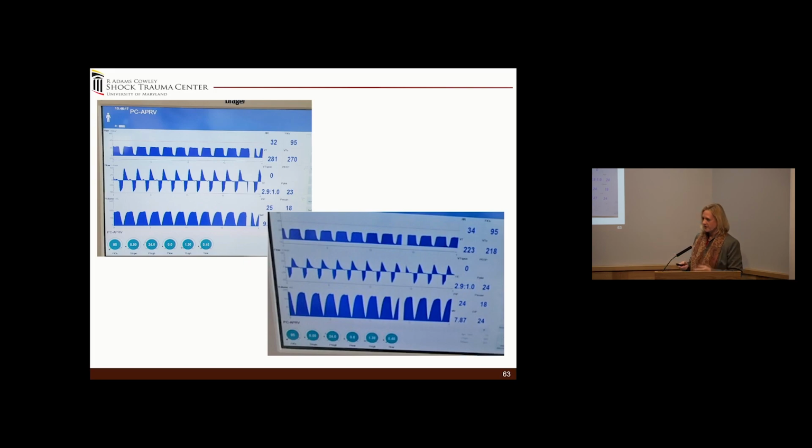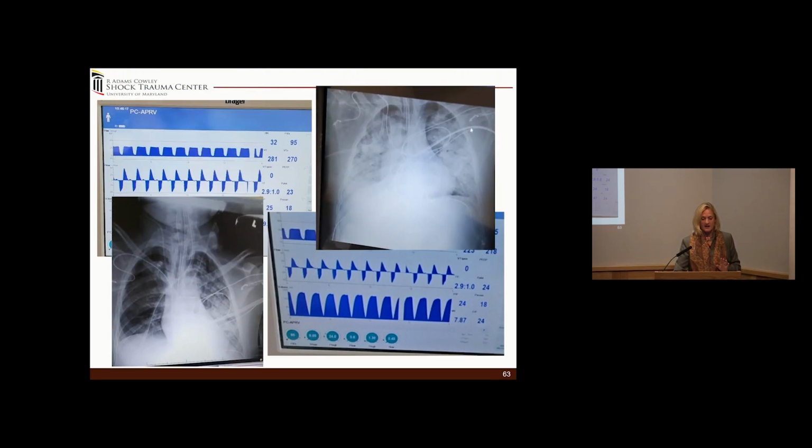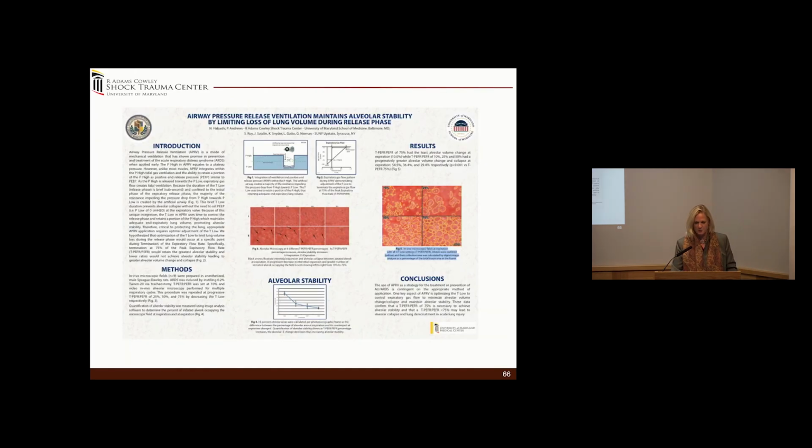This is actually an example. Funny how that happened. So here is a T-low of 0.45, and you can see the angle here, and this is 75%. And then now this patient, here is the chest x-ray. It's still ugly, trust me, that's not good, but it got uglier. And this happened when the patient was disconnected, and the tubing was disconnected inadvertently. And look at the loss. So now, just to blow it up, look at the angle changed. This is a little blurry, sorry, but I have a 45-degree angle here. It got steeper, and now my 75% is up here versus down there. So I needed to take that T-low and go from 0.45 back to probably about 0.35, I think, which is what we did.